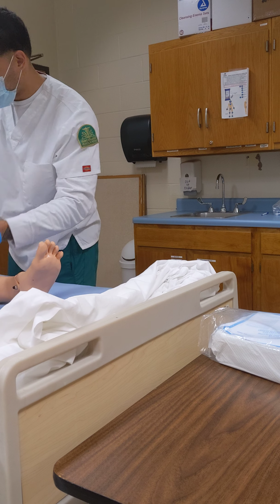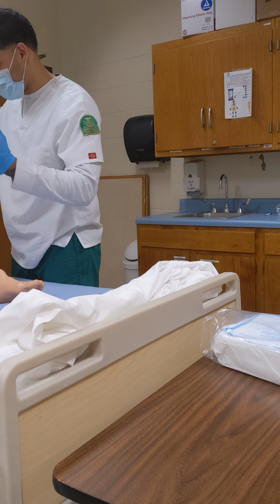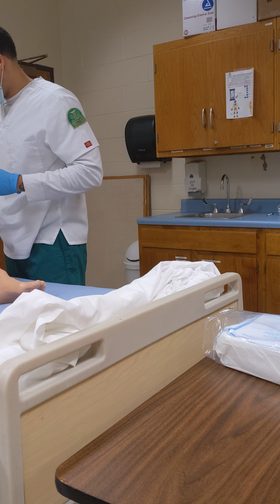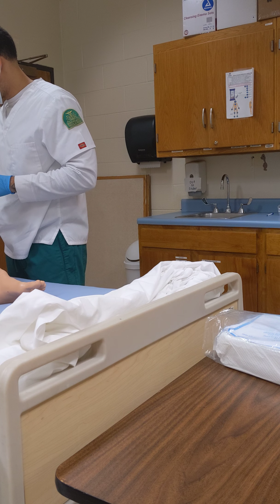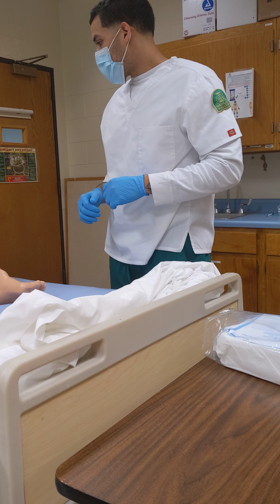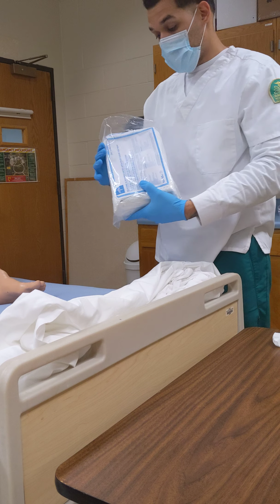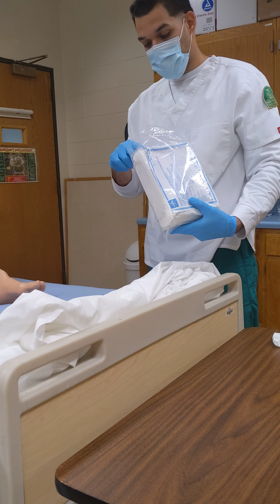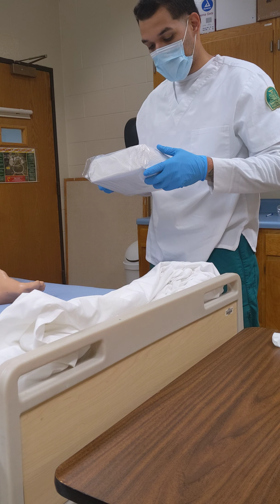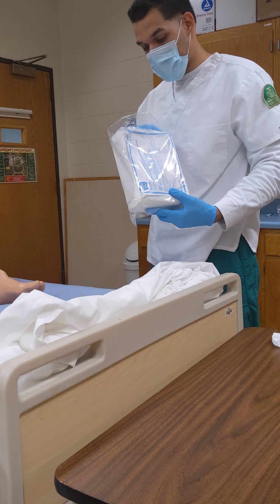Oh, sorry, I'm supposed to lift the client's legs prior to pericare so that it gives more room to work with and they're more comfortable and proper hygiene is done. After pericare, I want to check the expiration date on the kit to make sure that it's not expired and that it's the appropriate size for the person and the right order as well.